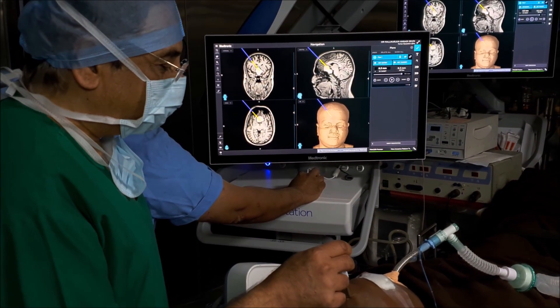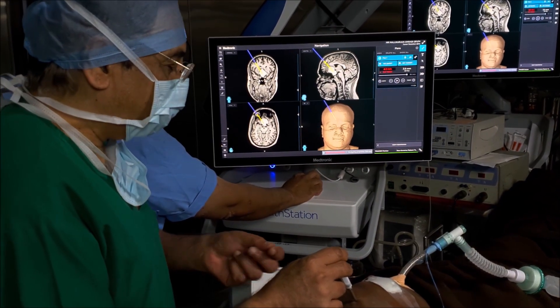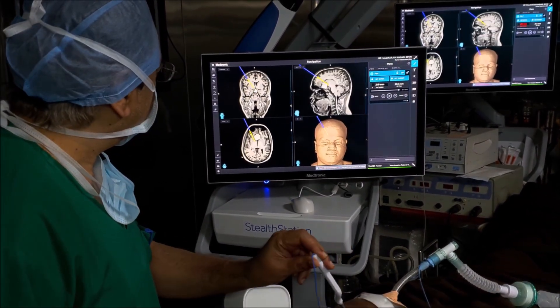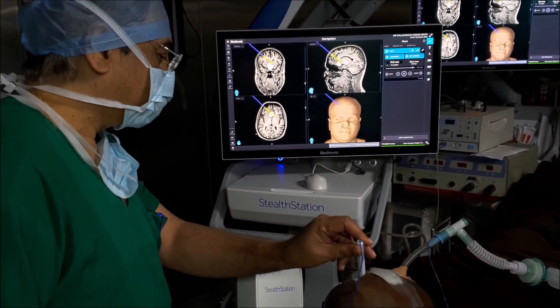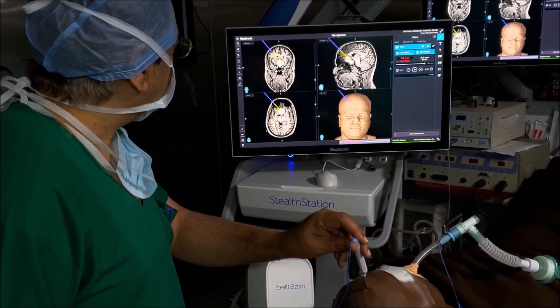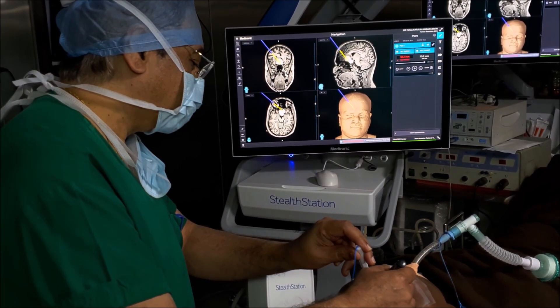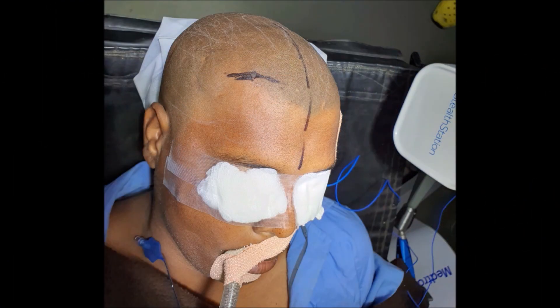We prefer to go from the paramedian, about one to one and a half inches laterally, accessing the cyst because the optic chiasm, optic nerves, and the anterior circle of Willis are located in the midline on the surface of the cyst. If you go to the midline, we may injure the optic chiasm and optic nerves. It is always better to access the anterolateral wall of the cyst. Navigation planning gives us a safe and comfortable entry location.